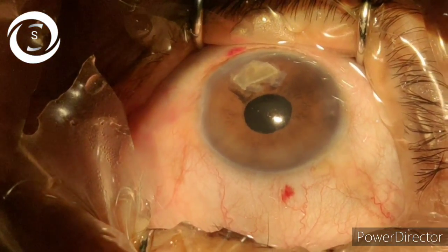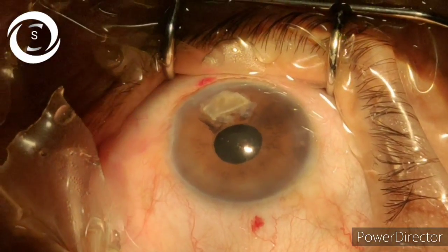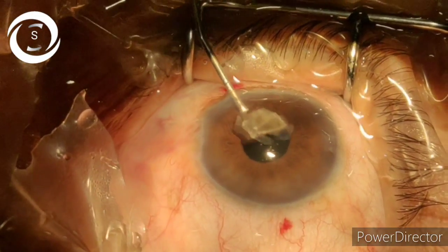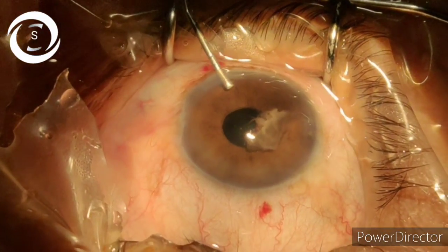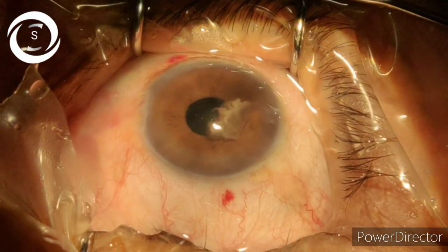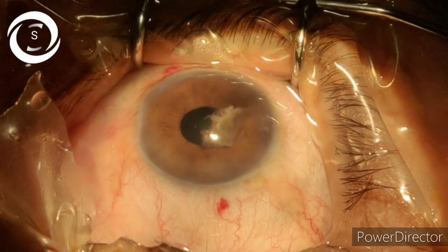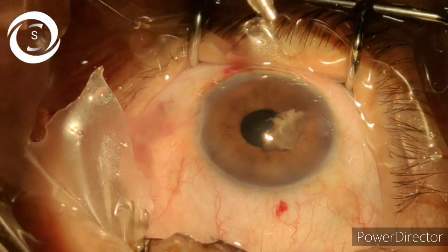The next day, a large piece lies at six o'clock in the anterior chamber and you are forced for secondary intervention. The same occurred today with me. This piece you are looking at in the anterior chamber was deeply hidden under the iris. I was about to hydrate the wound to conclude the surgery, but then I thought I should sweep under the iris, because the pupil in this case was not fully dilated and it was a very hard nucleus. So I tried a 360-degree gentle aspiration with an IA cannula and suddenly this piece emerged in the anterior chamber.